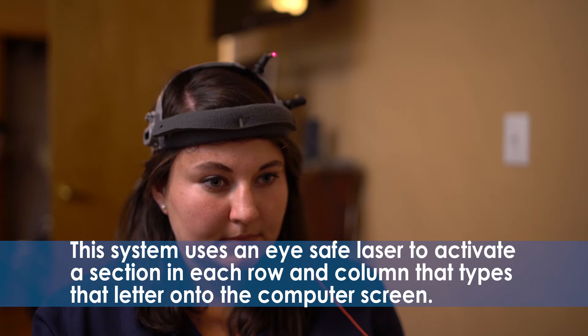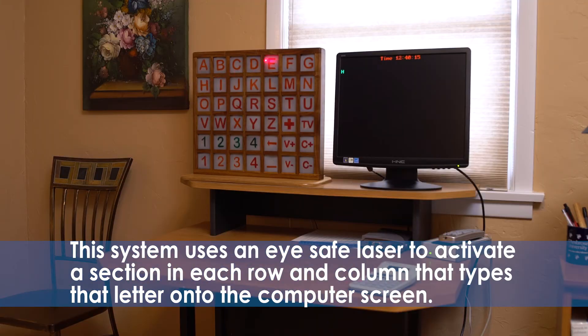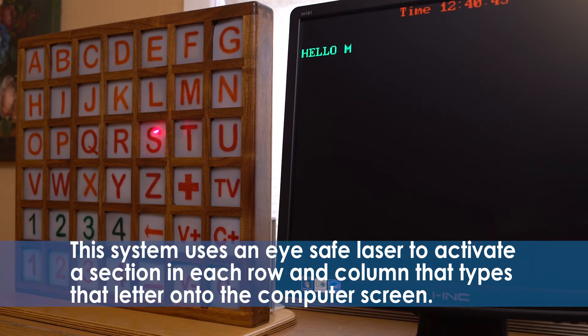This system uses an eye-safe laser to activate a section in each row and column that types that letter onto the computer screen.